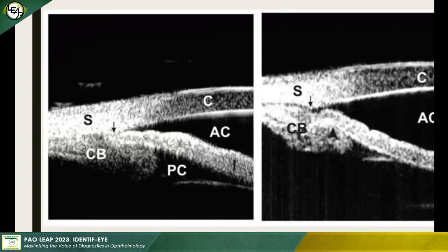And if you notice, the ciliary body is rotated anteriorly. So the ciliary body, CB, is rotated anteriorly, and note the very steep angulation of the peripheral iris, how it dips centrally and then moves back up again centrally as you approach the lens equator. So this is an instance of plateau iris. So for this patient, you might want to consider peripheral iridoplasty.